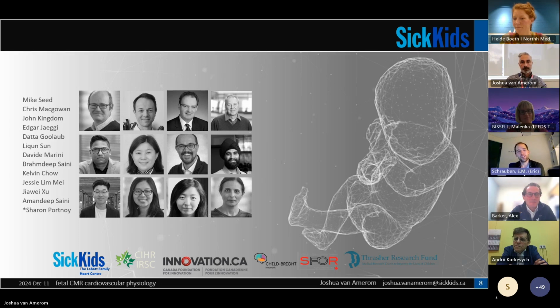I think it's difficult. I agree that overall the best approach going forward will definitely be placing a box around the heart, finding a good way to know when motion is happening, finding a good way to correct that motion, and measuring everything much later retrospectively. But of course, much later is not always soon enough.